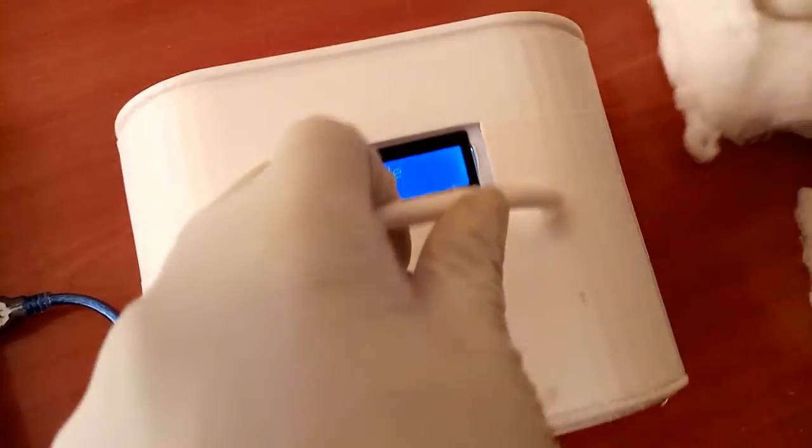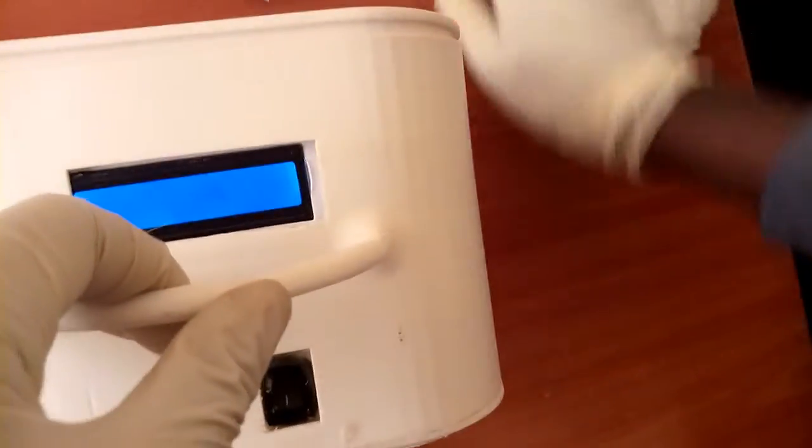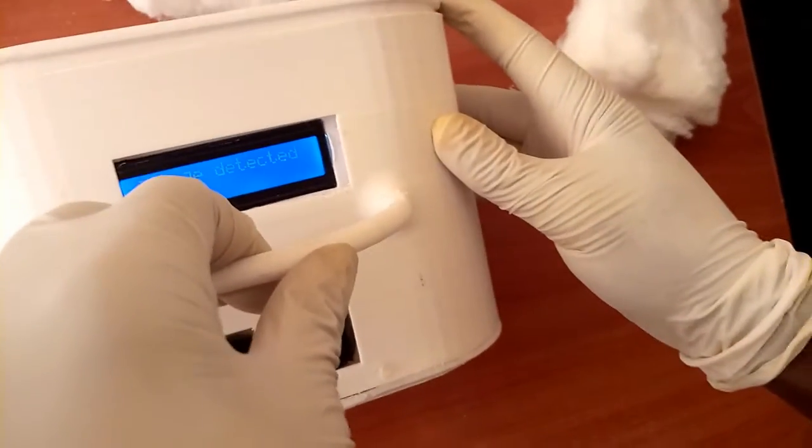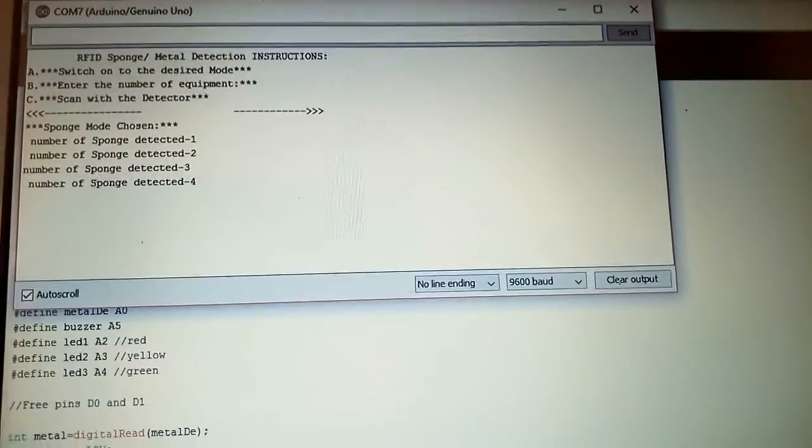So I'll try to detect the first sponge, second sponge. It can also detect the card, the tag. So it will be displaying on the serial monitor so that the health practitioner can know the number of sponges used in a surgical operation.